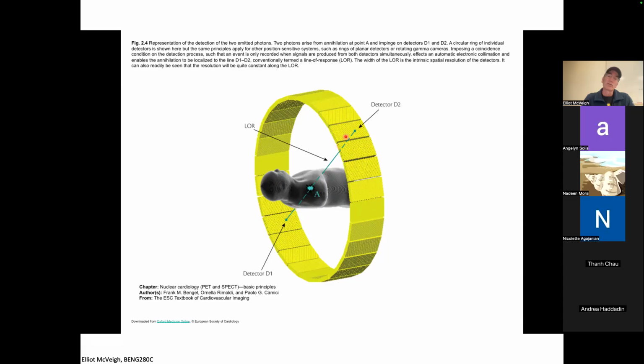So what we can do is look for coincident flashes because they're going to hit the detector at the same time. The speed of light from here to here, we're talking under a nanosecond or something, around a nanosecond. So it's a very short path length. So unless you have a super high frequency detector working up in megahertz or something, you're going to see this as essentially a coincident event, a flash here and a flash here.